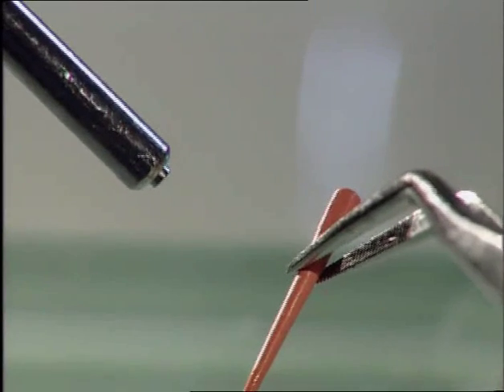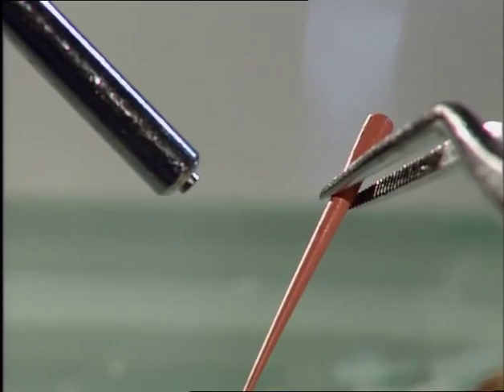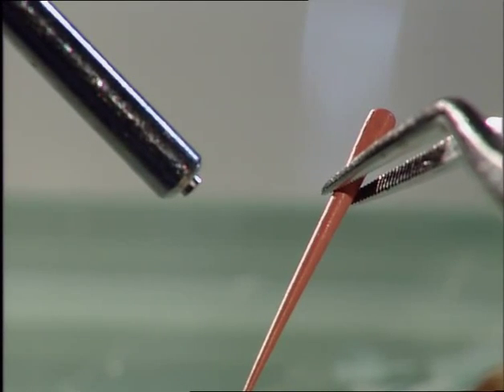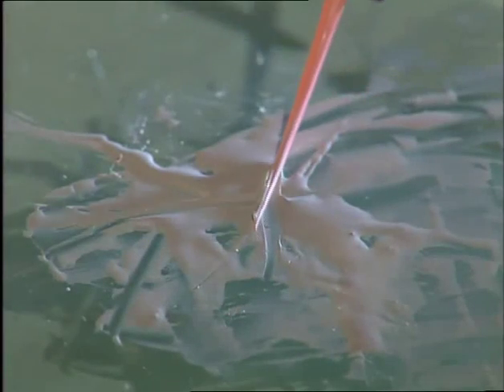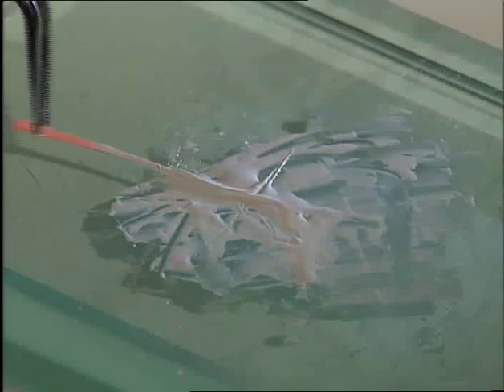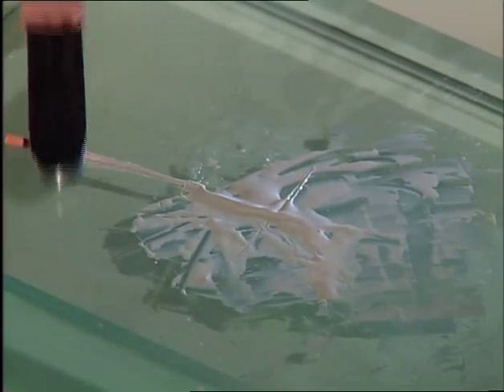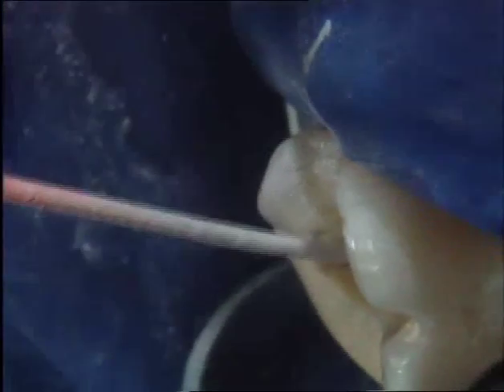The master cones are sterilized in sodium hypochlorite, rinsed in alcohol, and dried with the air-only syringe. Remnants of sodium hypochlorite get eliminated and the cone becomes stiffer. The pre-fitted master cone is slightly buttered with sealer. The sealer should be mixed somewhat thicker than the manufacturer's recommendation.